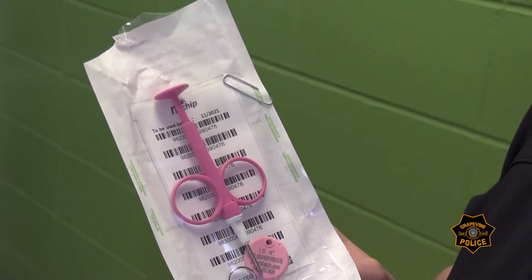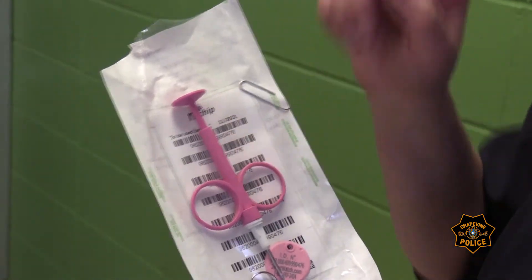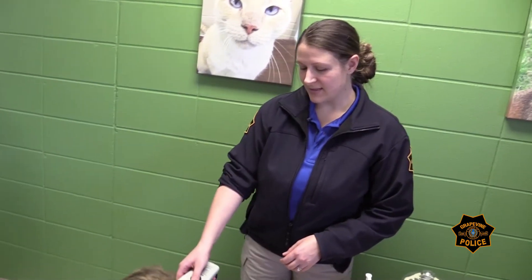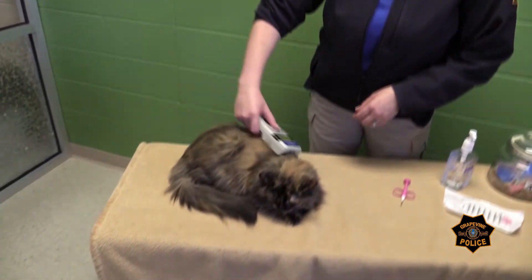A microchip can be implanted in seconds. This is what we use to implant the microchip — it's about the size of a vaccine needle. First, we scan the pet to ensure that they're not already microchipped.